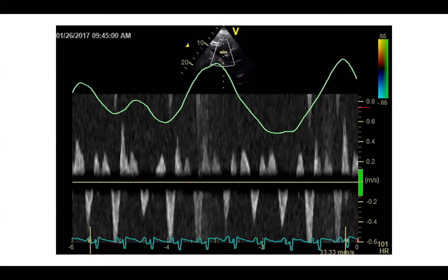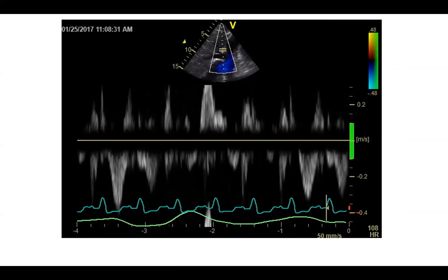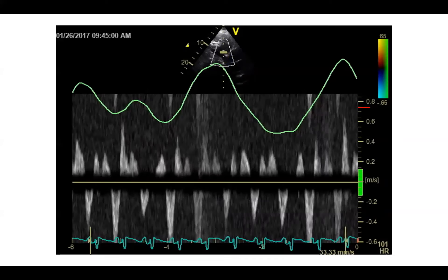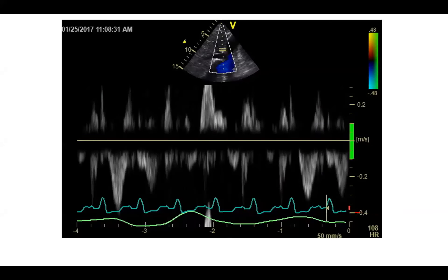Here's another case — hepatic vein flow. In expiration, you get massive reversal of flow versus inspiration. This is very suggestive of a pericardial process. Now I will make it confusing — this is actually tamponade, not constrictive pericarditis. In tamponade, you do get pronounced respiratory variation as well.